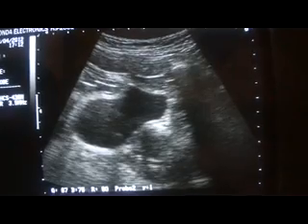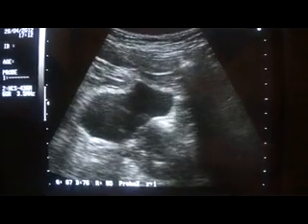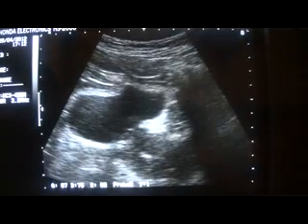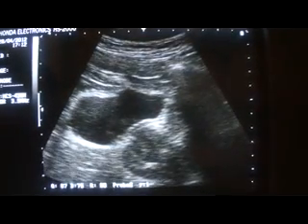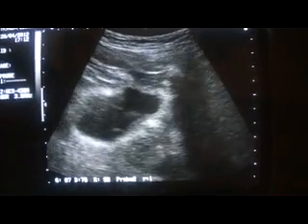This is the prostate gland in longitudinal section and this is the prostate gland in transverse section.